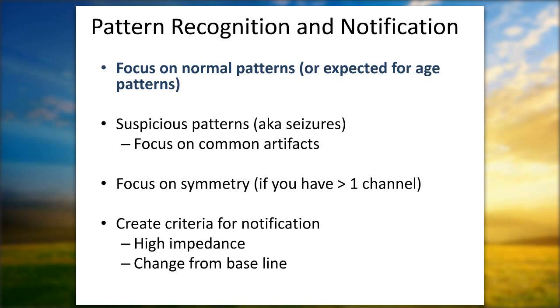There's a question about whether or not aEEG should be used as an indication for cooling. This is a great question, actually. I think that aEEG in and of itself is a helpful tool for us during cooling. My personal opinion is that we used aEEG as a qualification when we were trying to figure out which kids were the sickest, when we didn't know whether or not cooling was safe. Based on the NICHD whole body cooling trials that didn't use aEEG as a qualification, we still see a favorable benefit.